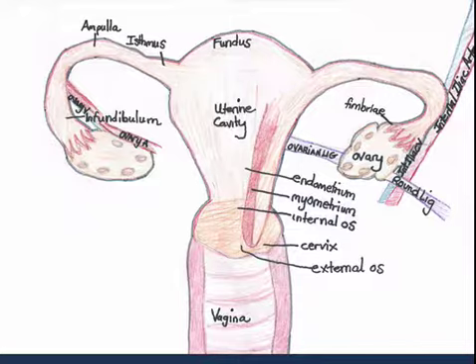We can differentiate the endometrium and the myometrium of the uterus, as the endometrium is hyperechoic in comparison to the myometrium. Lateral to the uterus, we can often identify the ovaries in their position medial and anterior to the internal iliac artery and vein.